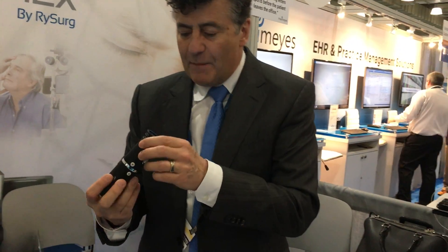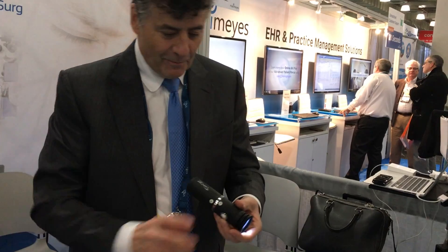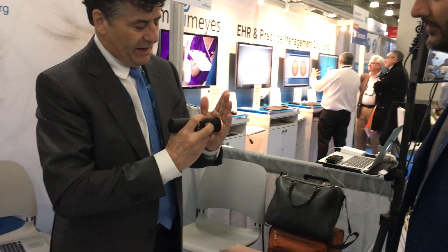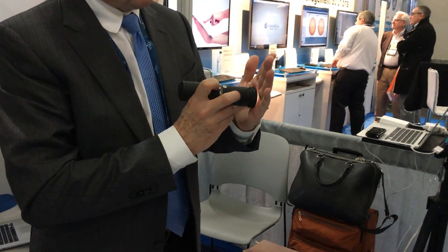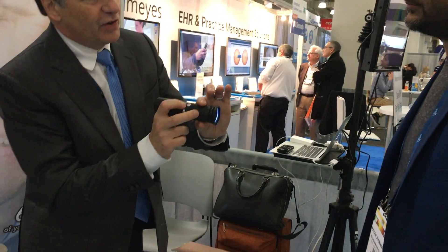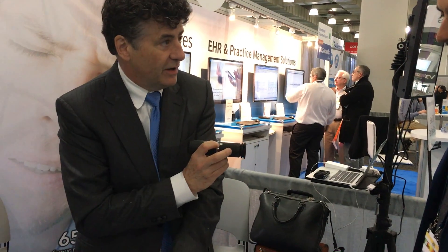You want to focus and snap your pictures. When you're actually using it clinically — not demonstrating at a booth — you hold it like this and approach the patient. The middle finger controls focus, the index finger takes pictures, and the index finger also zooms in. It's important when you come up to the patient to have the focusing knob at your 3 o'clock — that gets you oriented correctly.